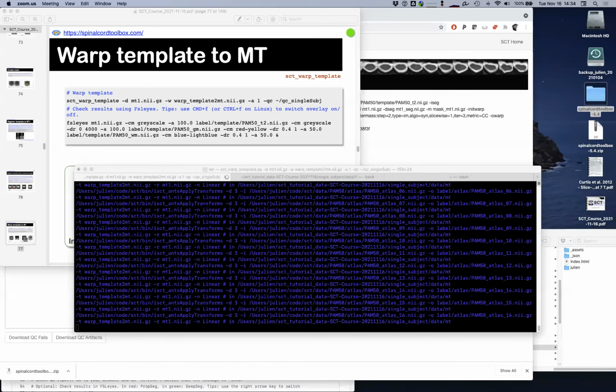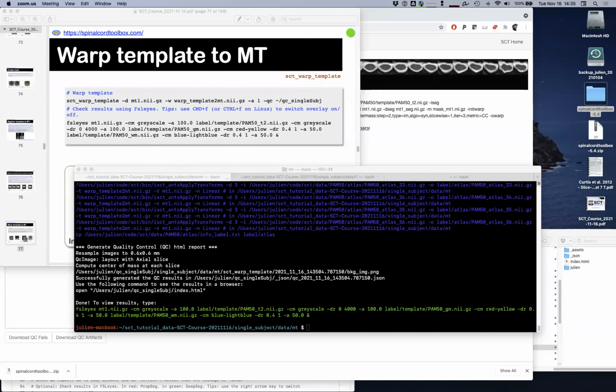Julian, I just have a question regarding different versions of the Spinal Cord Toolbox. I actually have a fairly old version that I'm using right now because I have a paper that's in progress, so I don't want to upgrade to 5.4 yet. I have several versions in different subdirectories, and I have a hyperlink which points to whichever one I want to use for a particular day. Are there any other issues regarding libraries that I should be aware of? Is each version self-contained within each folder? There should be no touching. That is the beauty of this.